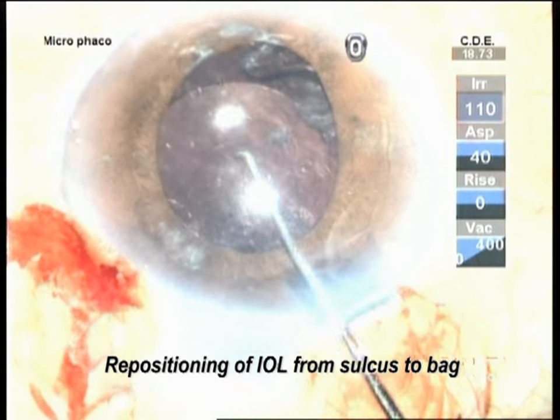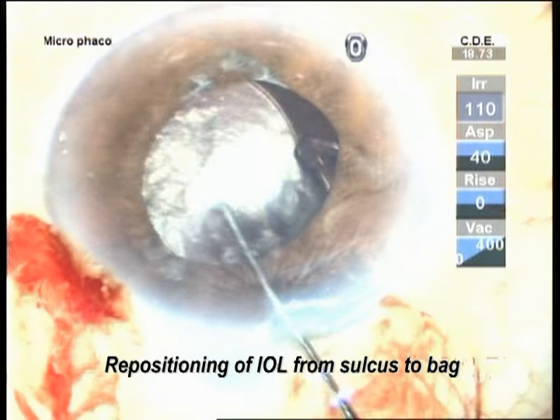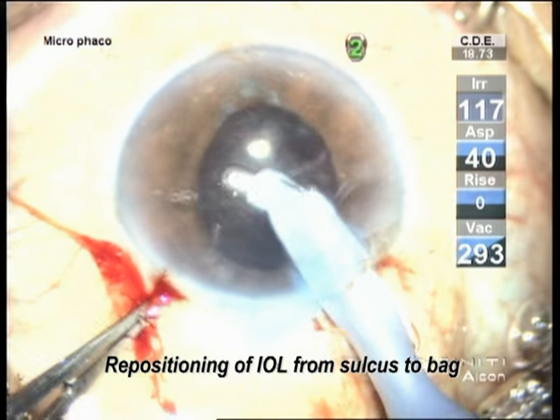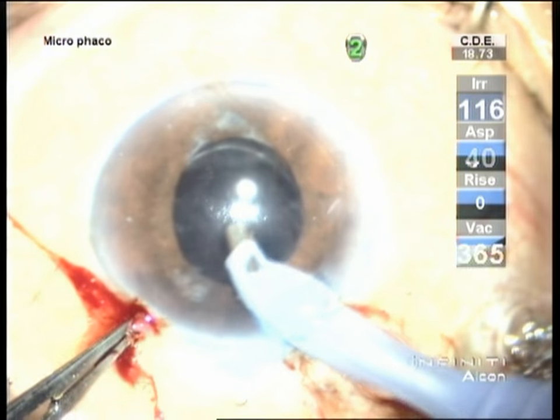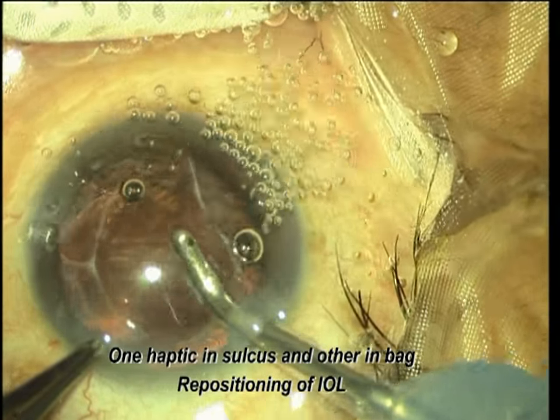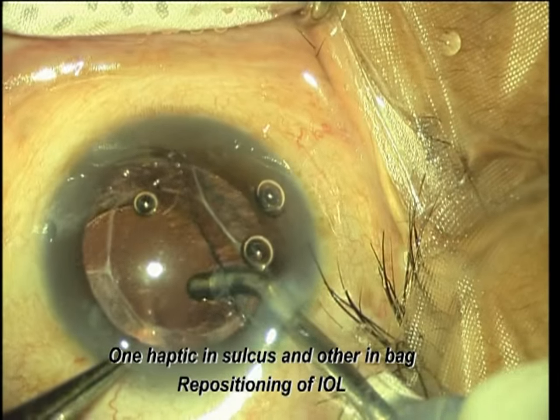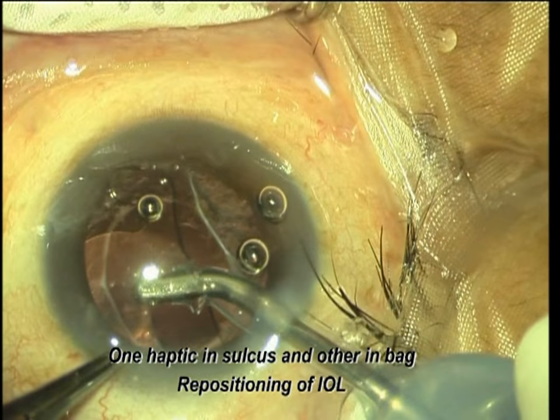Remove all the capsular material, wash the posterior capsule, and clean the chamber. This is another case with a hydrophilic lens where one haptic was in the sulcus and the other was in the bag.